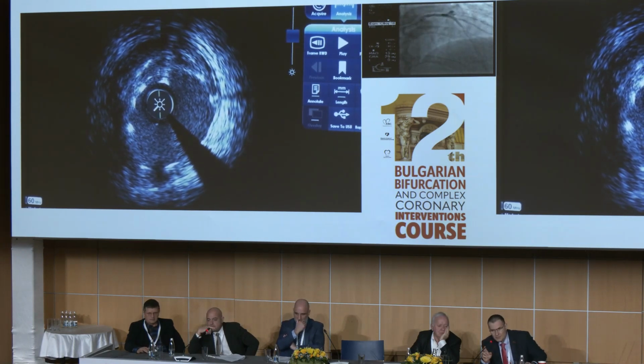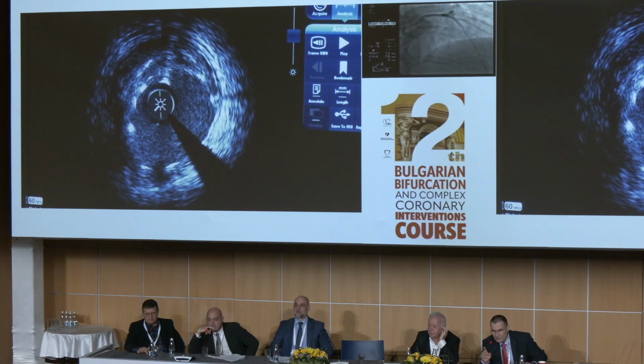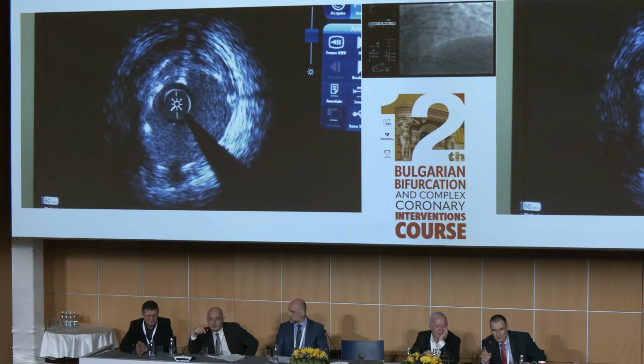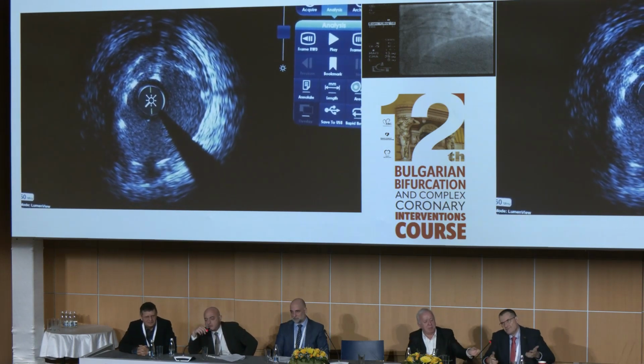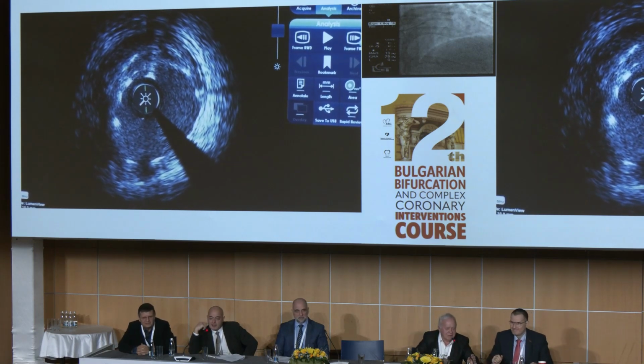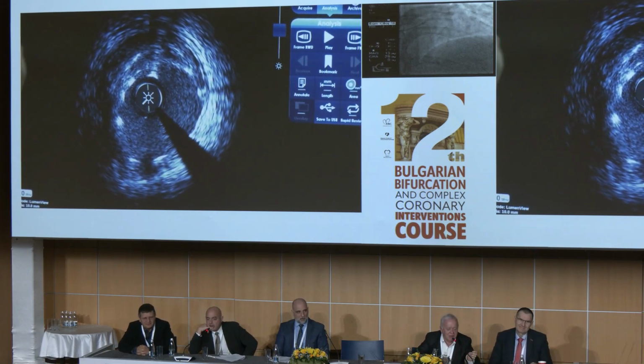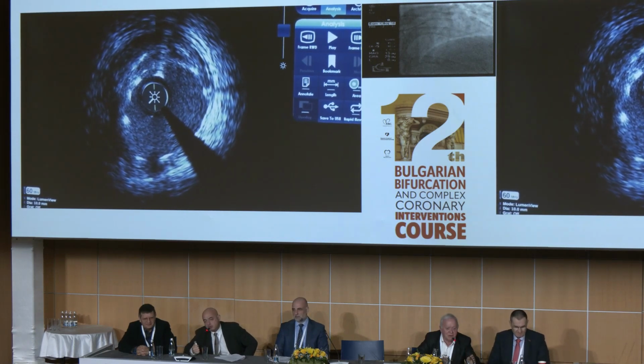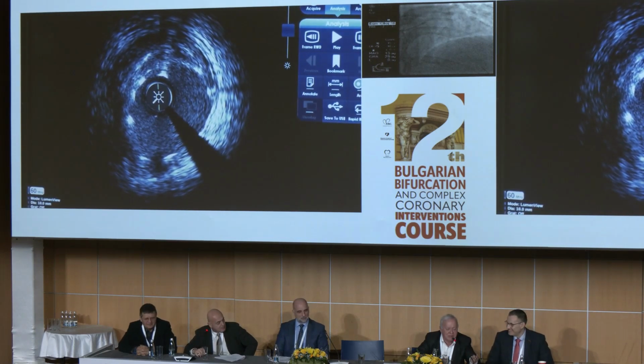Can I ask you to do a stent enhancement with both markers of IVUS inside the stent? We removed the IVUS, but we can use a balloon, just for the stent booster. Is that because you are trained at the other center to treat PCI with only angio guidance?